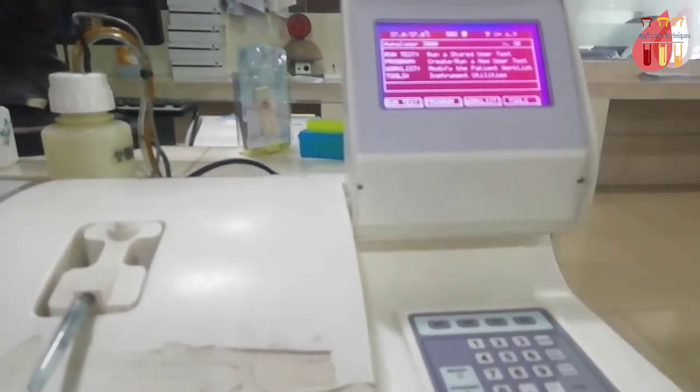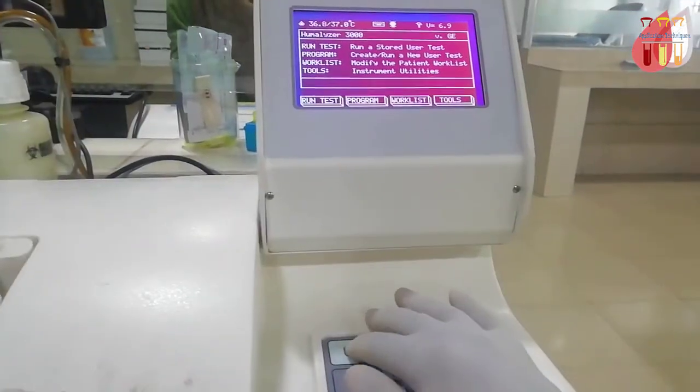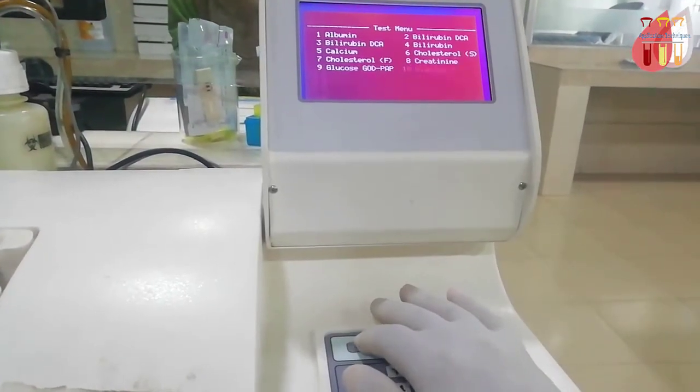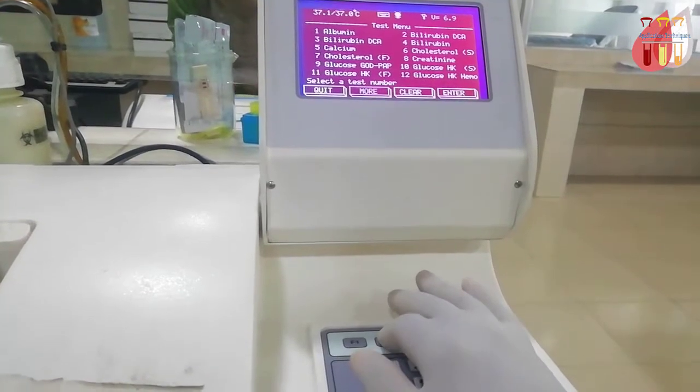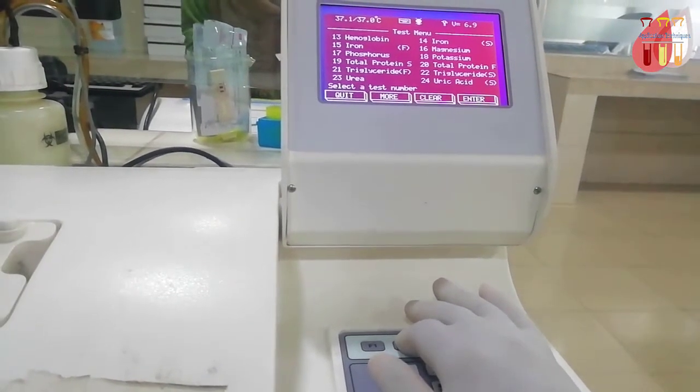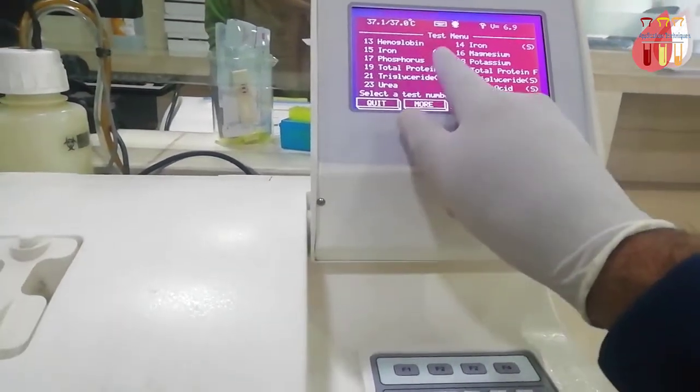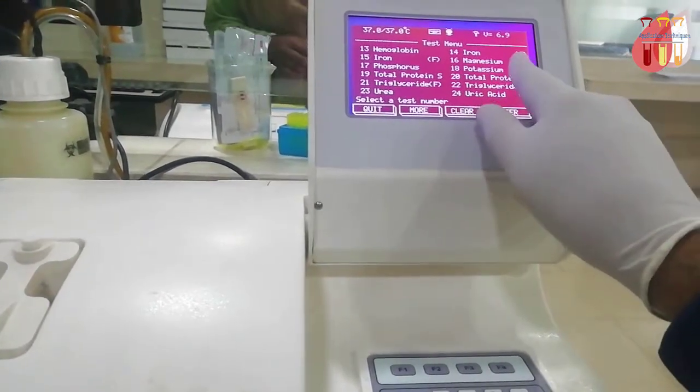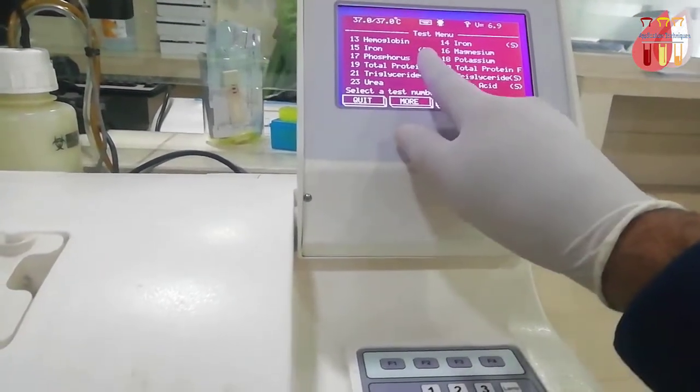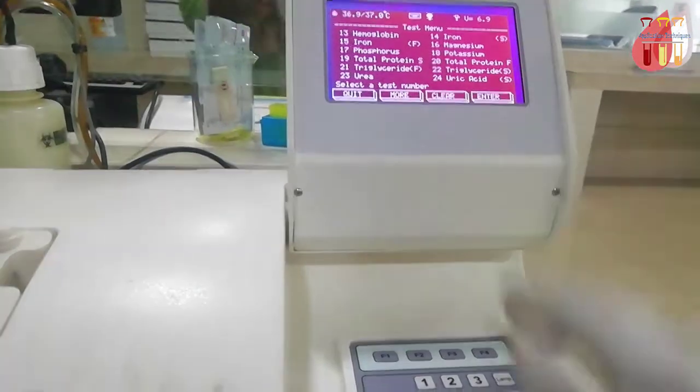Incubate for 5 minutes at 37 degrees. I'm performing the test on a semi-auto biochemistry analyzer, Humalyzer 3000, in program factor mode number 5 and standard mode.